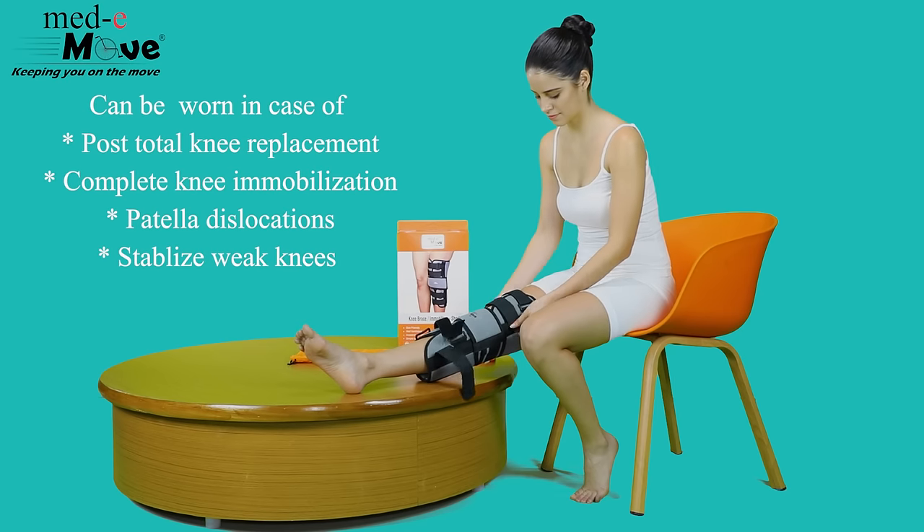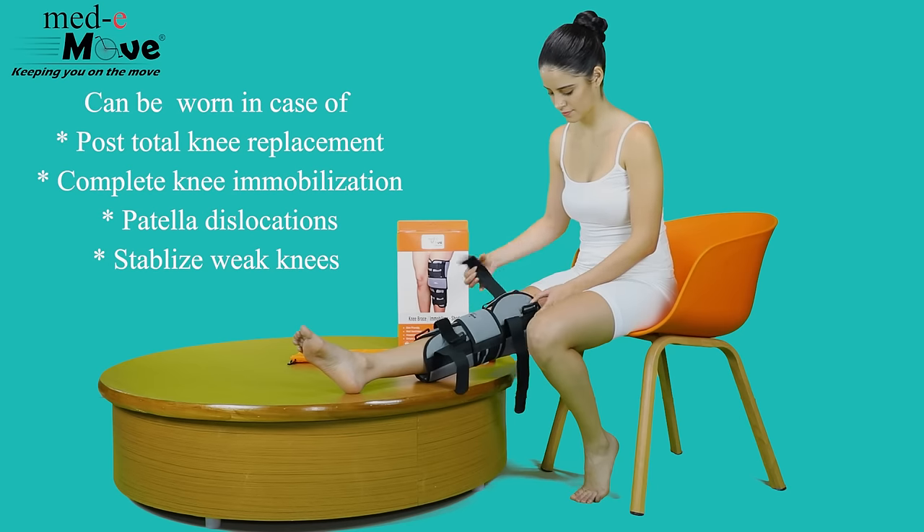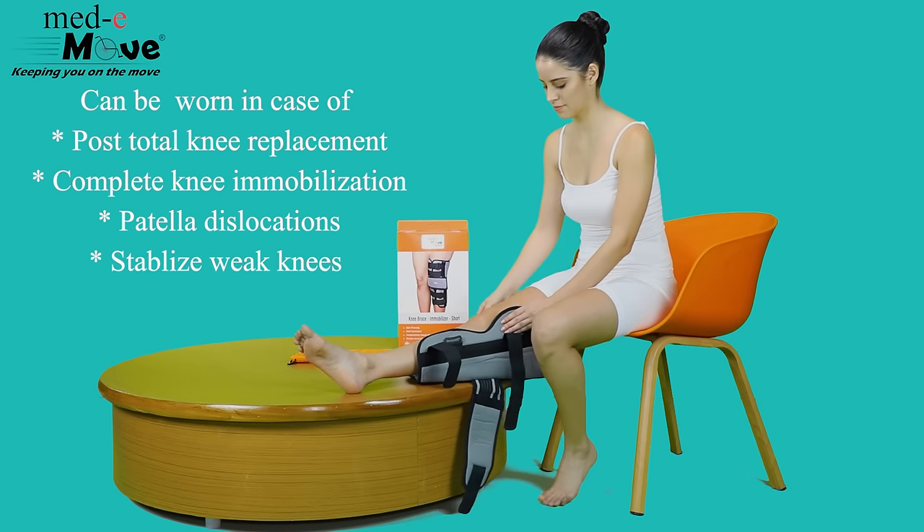The Medimove knee immobilizer short can be worn in case of post-total knee replacement, complete knee immobilization, patella dislocations, and to stabilize weak knees.